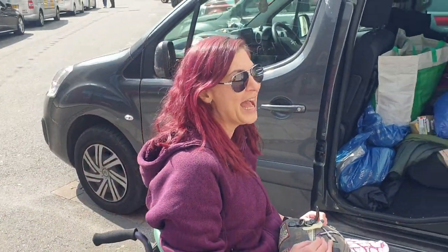They're good wheels, but how much were they? Three and a half grand — three and a half thousand pounds — which is why a lot of people don't have them. The emotion ones are worse though, because they're really sensitive. I'm pretty good at driving wheelchairs, but I bounced off every single wall down that hallway trying to ride that thing. And there is one downside with these e-move wheels: if you get a flat tyre, you go round in a circle like you're possessed — they spin round on the spot. So you've got to make sure your tyre pressures are sorted, or at least keep a foot pump in the car. I've learnt that lesson.